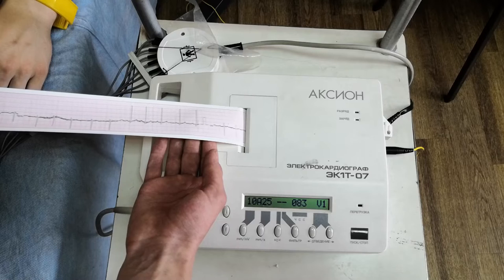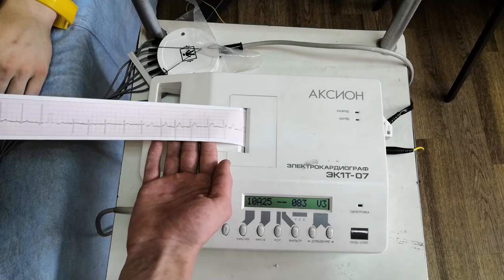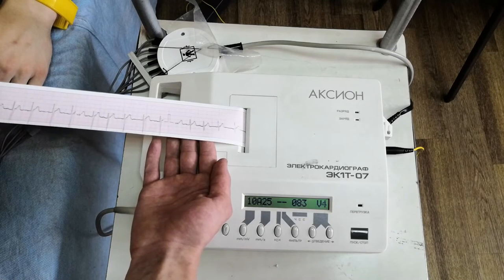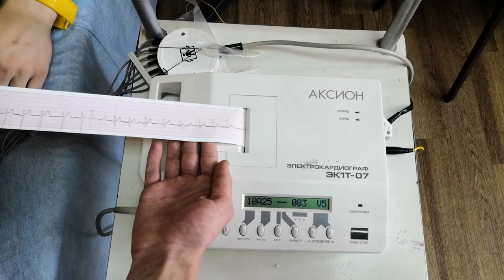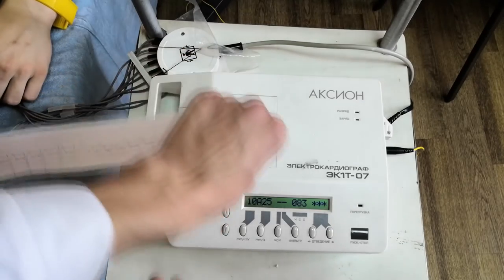ECG is a sequential recording of a potential difference between the different parts of the body, the occurrence of which is due to the electromagnetic field around the heart during the spread and disappearance of excitement in it.